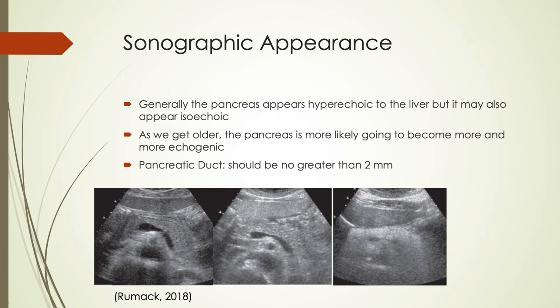When we look at the pancreas, it typically appears hyperechoic to the liver, but it could also appear isoechoic. The pancreas doesn't stand out too well because it is not an encapsulated organ. As we get older, the pancreas tends to become more echogenic because it stores more fat. The pancreatic duct should never measure anything greater than 2 millimeters; otherwise it is considered dilated. Our resolution is getting better, so we can typically see the pancreatic duct more often now.